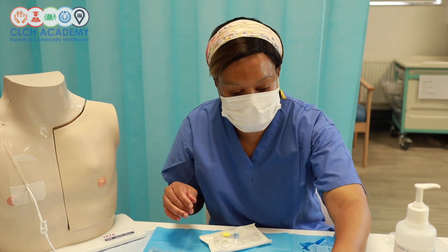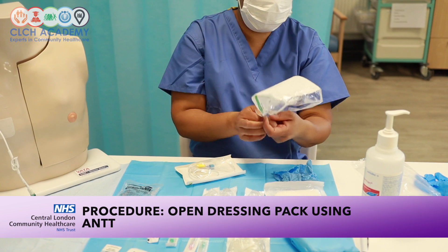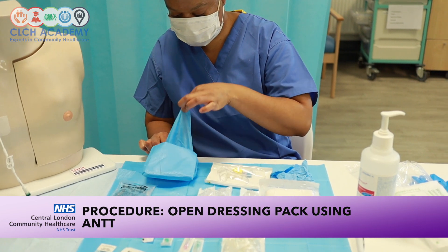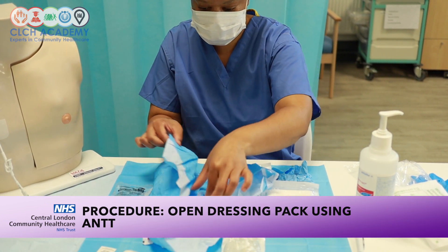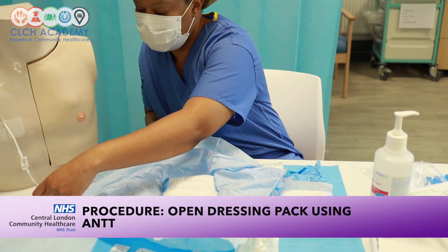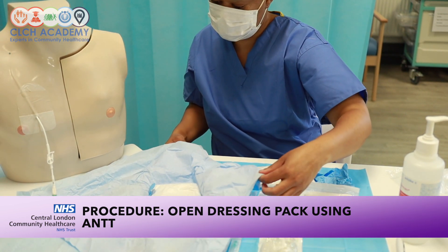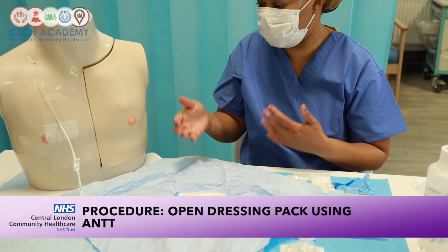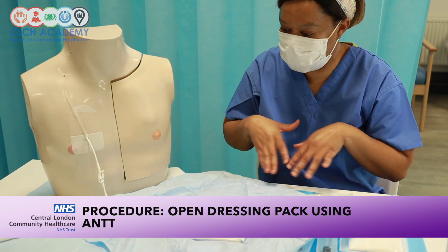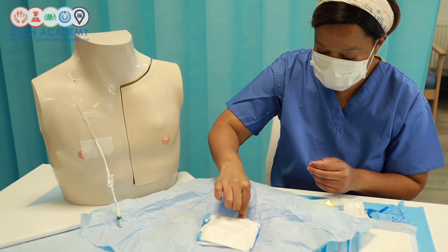Next, I'm going to open up my drapes and dressing pack. The key point here is to think about creating an aseptic field. Depending on the position of your patient — if they are seated — make sure your device is lined up within the drape to maintain management of the venous access device within the aseptic field. I'll also need my clinical waste bag.